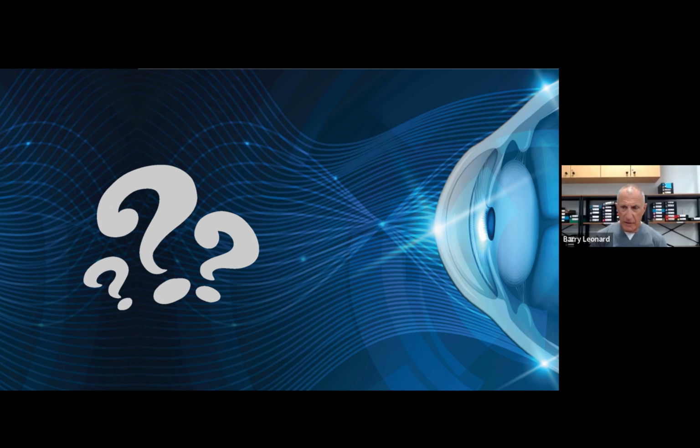Yeah, so I think that is it. We now have really 8 meridians. In the normal fit kit lens from Boston, we have 1, 2, 3, and 4 meridians, but now we really have 1, 1.5, 2, 2.5, 3, all the way around, and all those can be adjusted individually, up or down. Limbus, edges, all that can be done independently.